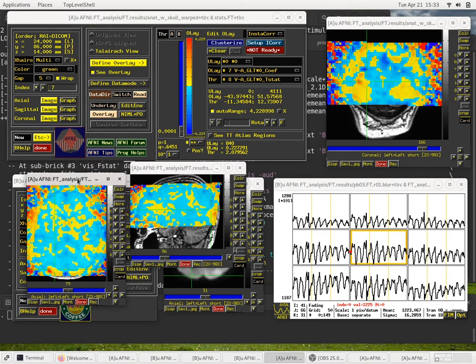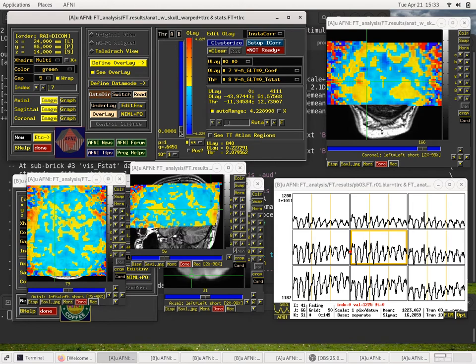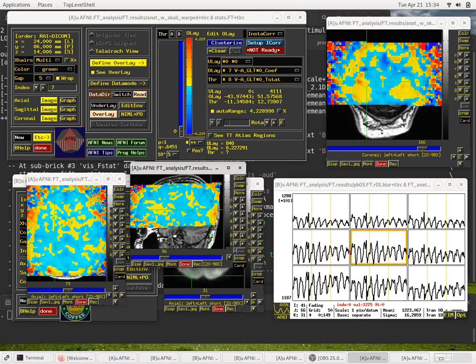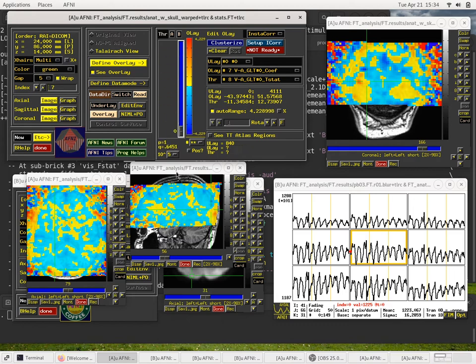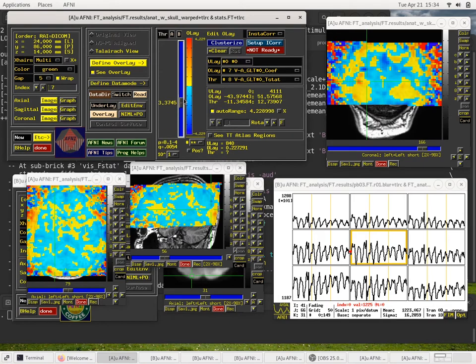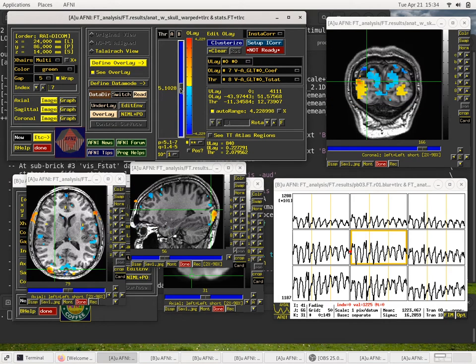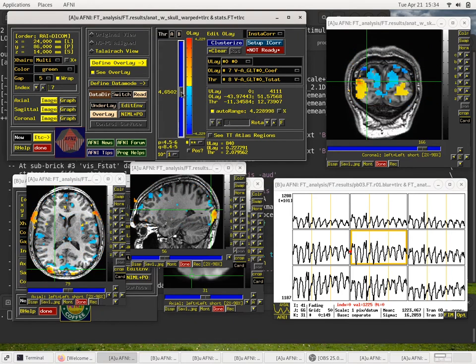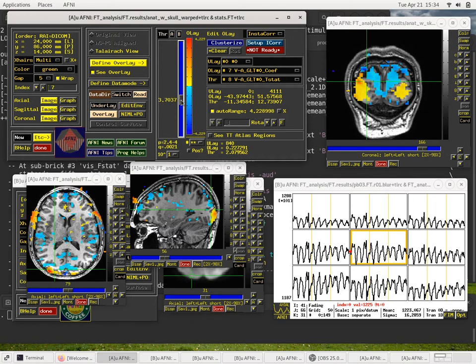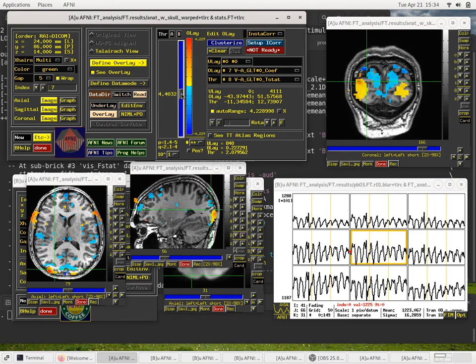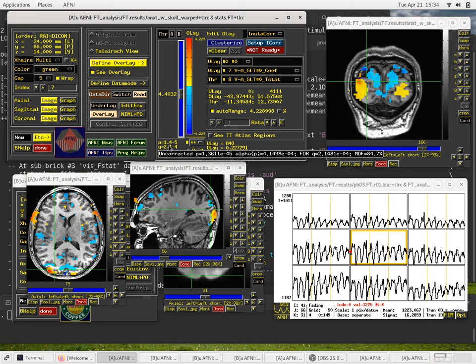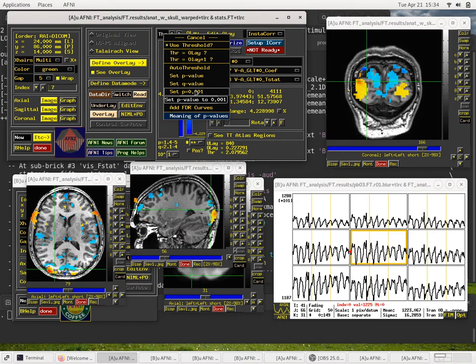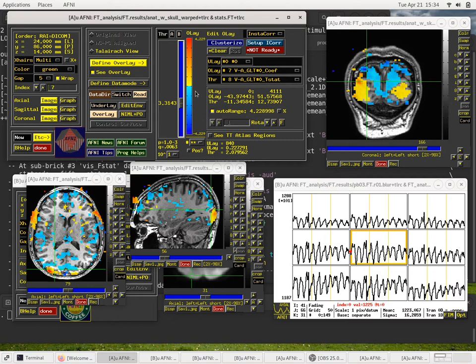Now let's set the threshold to something reasonable. We can drag the threshold slider bar around. This is defaulting to 10 to the first. You can change that to go from 0 to 1, 0 to 10 is the default. If we want to pick just something simple to look at, we might choose to drag the slider up until most of the speckly stuff outside the brain disappears. Or we could right-click on THR up here and set the p-value to something in particular. Or even go straight and set p-value equals 0.001.